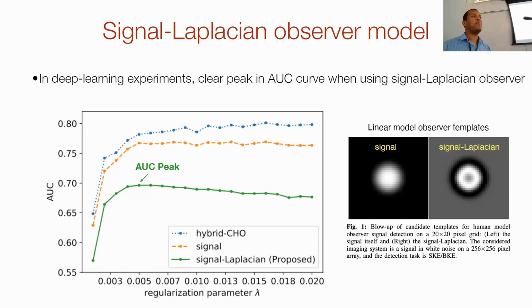So we might be skimping on the side of good modeling of human observers, but it's something in the ballpark that can be readily computed, so you don't spend all your time computing the model observer, and instead you can focus on mapping out the parameters of the image reconstruction. But it's a good point.